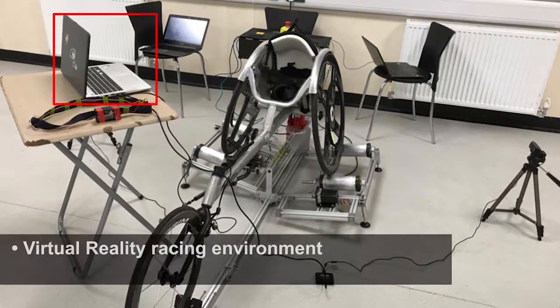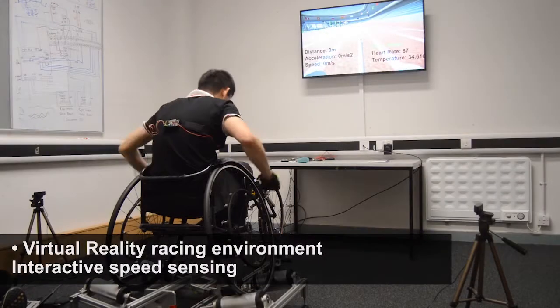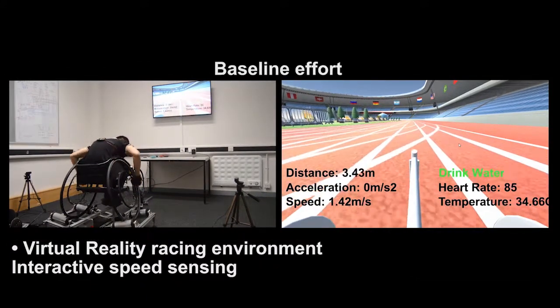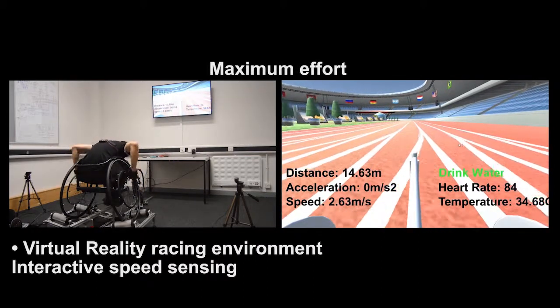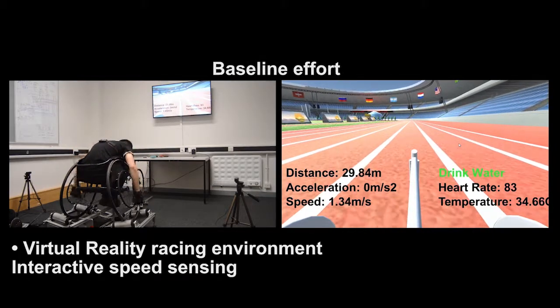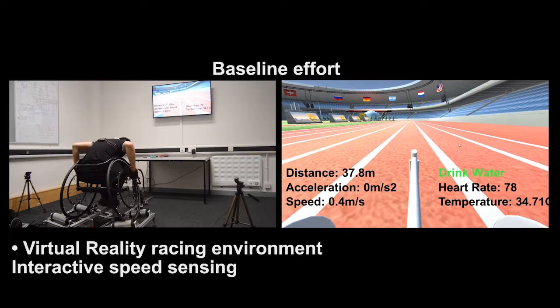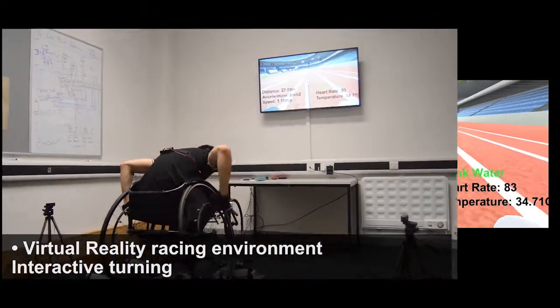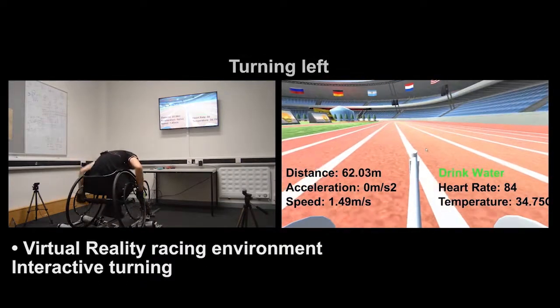The next main aspect is the new and exciting virtual reality component of the system, which delivers an immersive virtual racing environment for the athlete. Starting with speed sensing, the virtual reality can mimic the speed of the wheelchair as if the athlete is on a real track. The virtual reality component can also differentiate between right turns and left turns of the wheelchair.